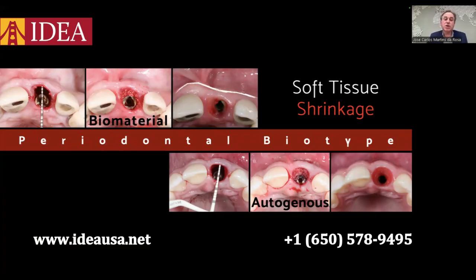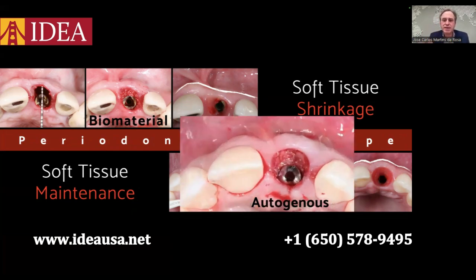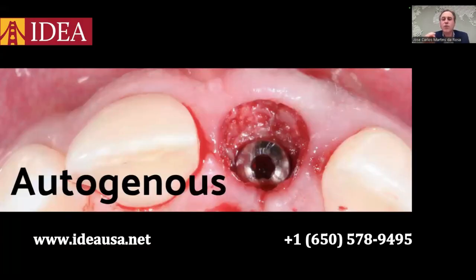In the case that we only use autogenous bone graft, you have the soft tissue maintenance. Look at this and just realize the difference between this outcome and this outcome. But it is always related to what kind of graft you are going to use in order to restore the defect. For sure, we only use autogenous bone tissue.